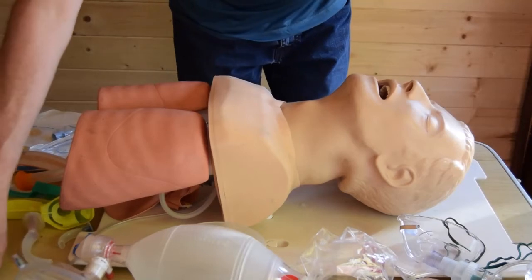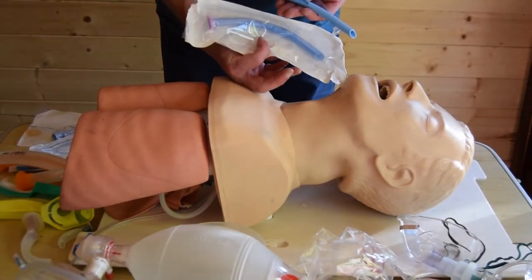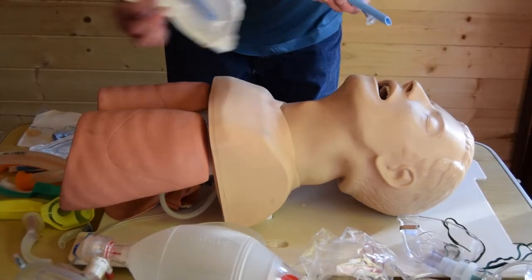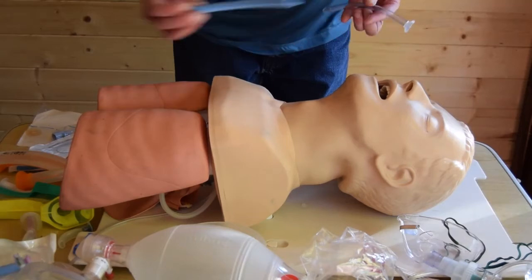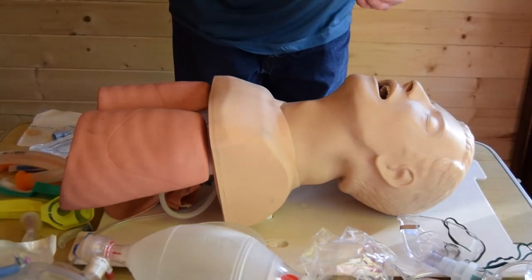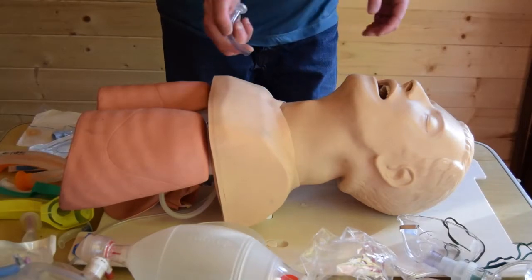The next one we're going to look at is the nasopharyngeal airway. I have some examples, various sizes here. That's a 9, it's a very big one. That's an 8, that's still quite big. And this one is a 7, so this is a reasonable size one. These go up your nose.